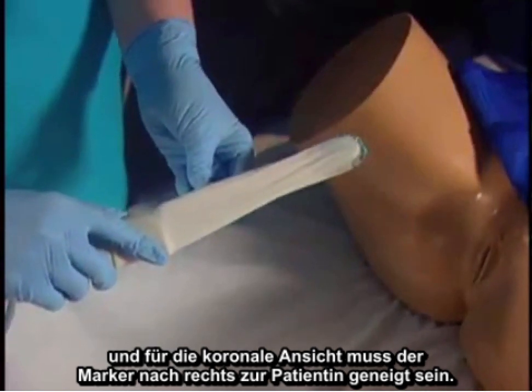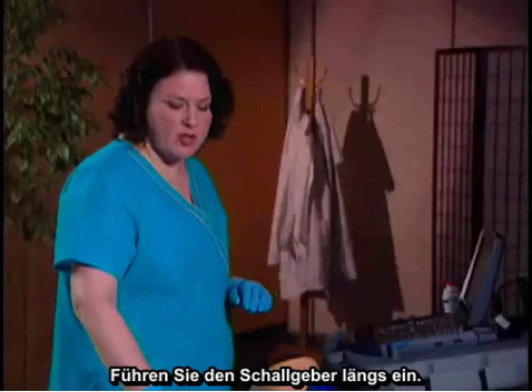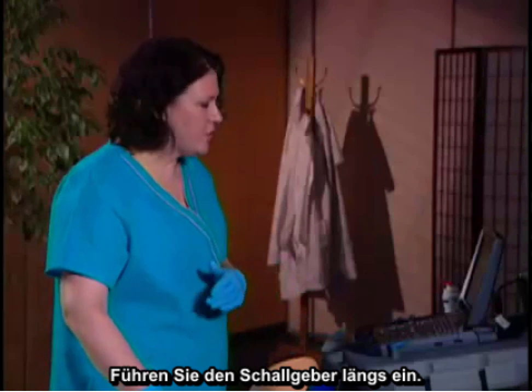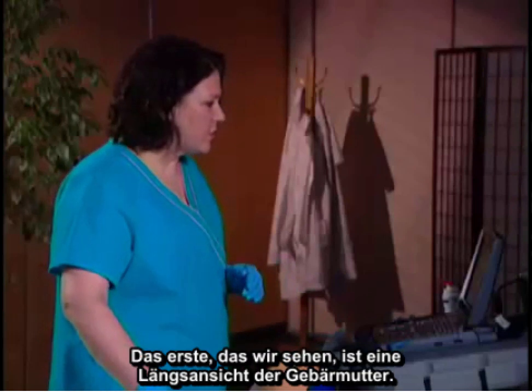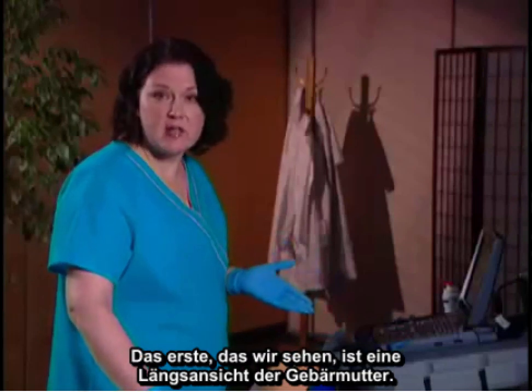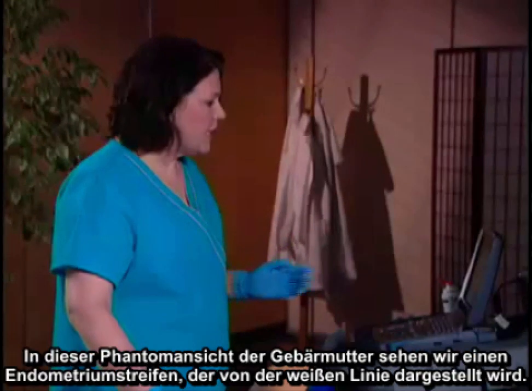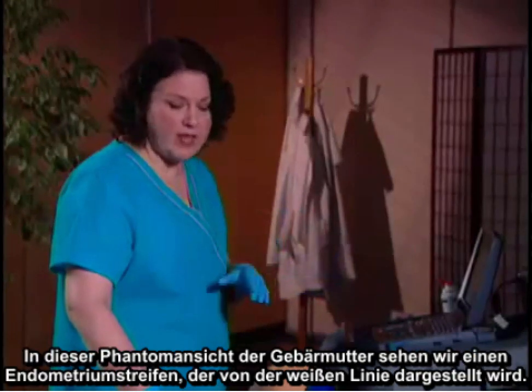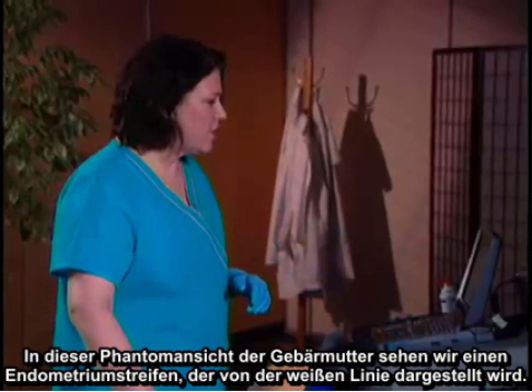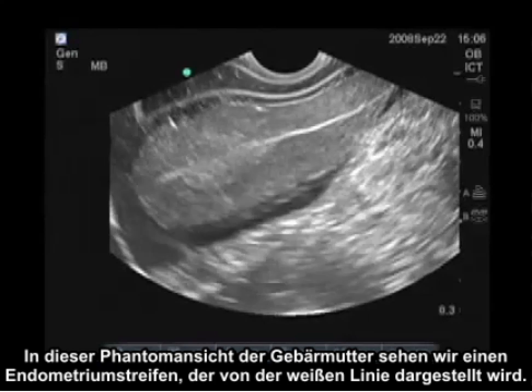After we've inserted the transducer in a long axis view, the first thing we're going to see is a long axis of the uterus. In this phantom representation of the uterus, we see an endometrial stripe, which is represented by the white line.